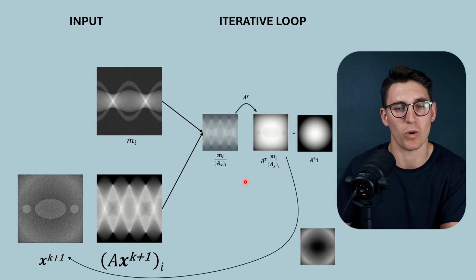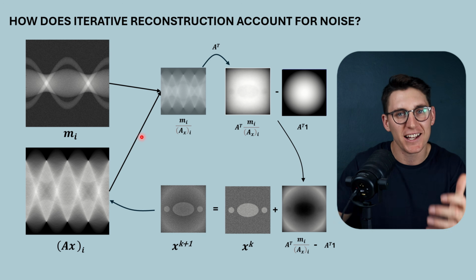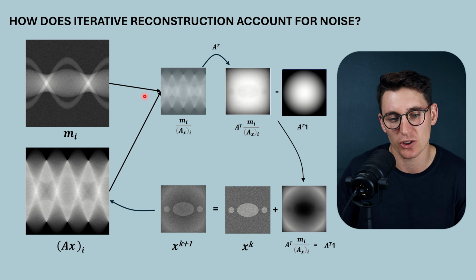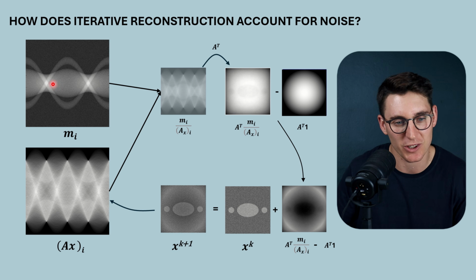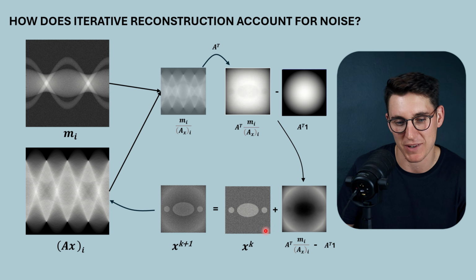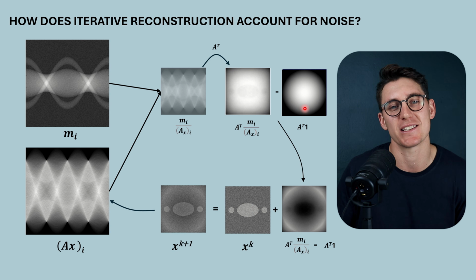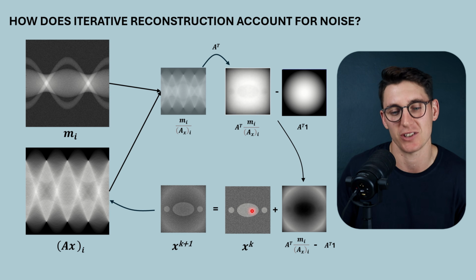But it's very difficult, one, to see how we're accounting for noise in here. I haven't seen any step that's taking out the noise in the image. Surely if we just start fitting the data closer and closer to one another, we're going to include the noise data here. And secondly, how do we know that this mathematics is sound? What is the basis for, say, taking away the sensitivity image here? What's the basis for adding the gradient image onto our initial estimate?